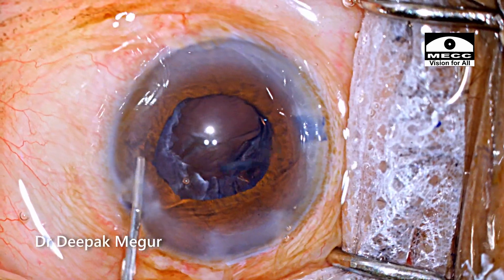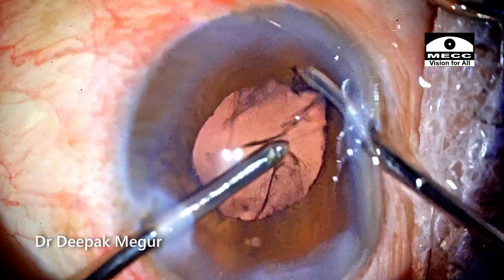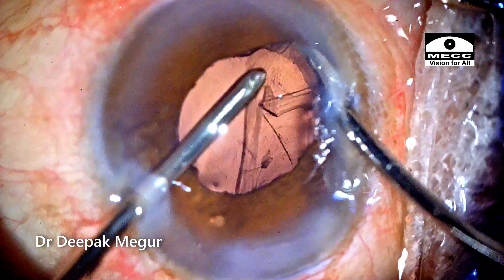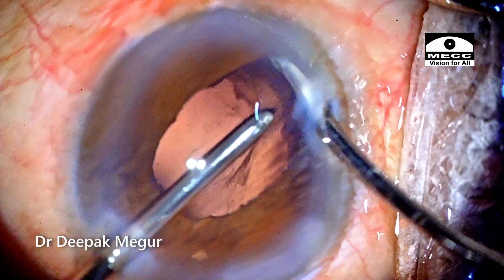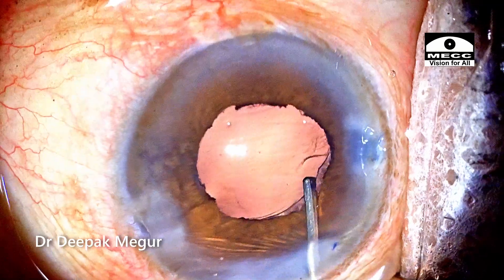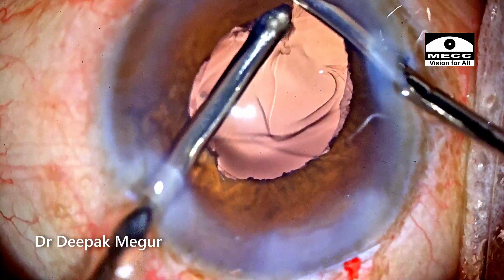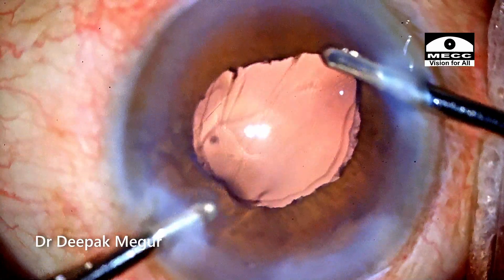Time to aspirate the cortex. The pupil is retracted using the irrigation handpiece to get better visualization and to ensure that I'm catching the cortex, not the posterior capsule. Some part of the cortex is sticking onto the posterior capsule quite strongly, so I'm going back with my BSS cannula to irrigate out the cortical fibers sticking onto the posterior capsule. The last bit of cortex is now aspirated out. Bimanual irrigation-aspiration definitely helps because the irrigation handpiece can be used to retract the iris and ensure that we are holding the cortex during aspiration — it improves safety a little bit.